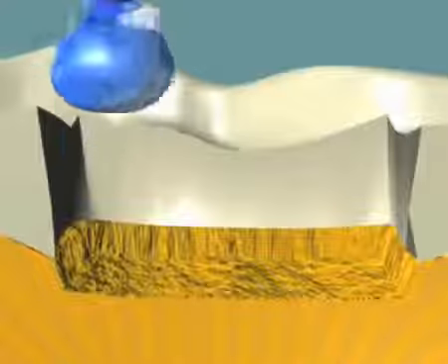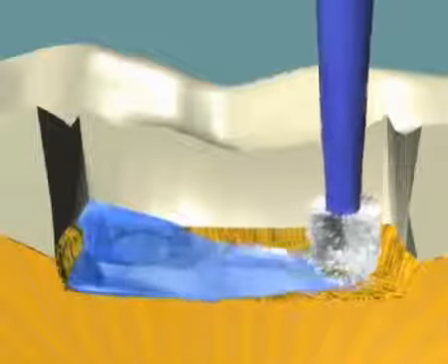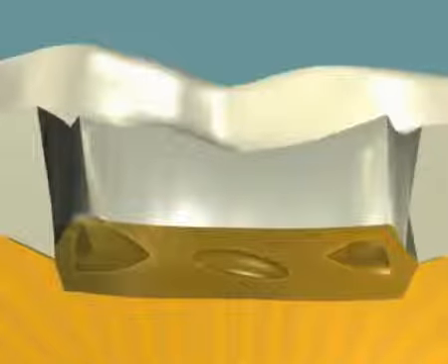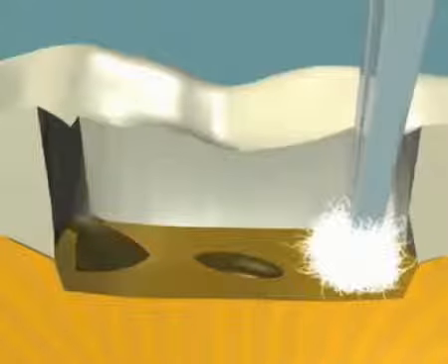Prior to placement of the glass ionomer, it is helpful to prepare the cavity surface by applying a polyacrylic acid conditioner. After 10 seconds, the conditioner is washed off, removing the smear layer and surface debris. Excess water is then removed without over-drying the surface.